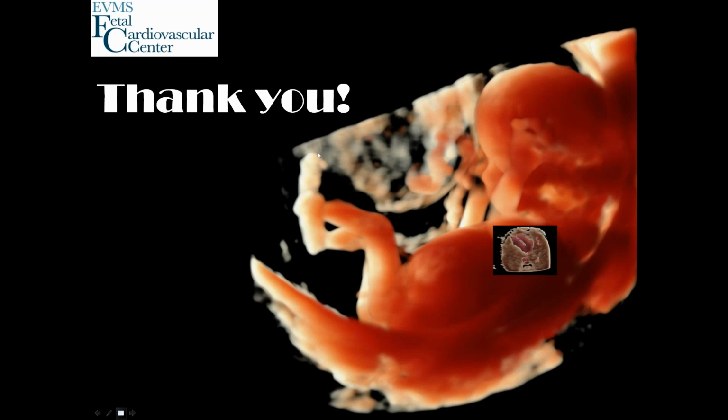Okay, I actually expected that last question. What is your opinion on bioeffects and using Doppler in the first trimester? Should we only perform it on high-risk patients, given the risk-benefit ratio, and if we can use it on everyone, what should we be telling our patients? I think it is critical to adhere to the guidelines that AIUM and ISUOG published about the use of Doppler in the first trimester.